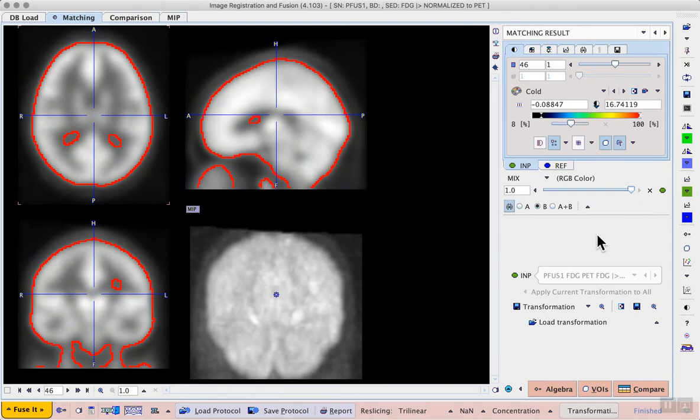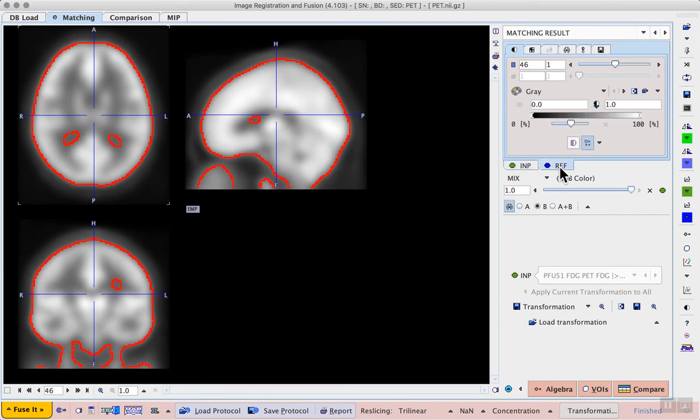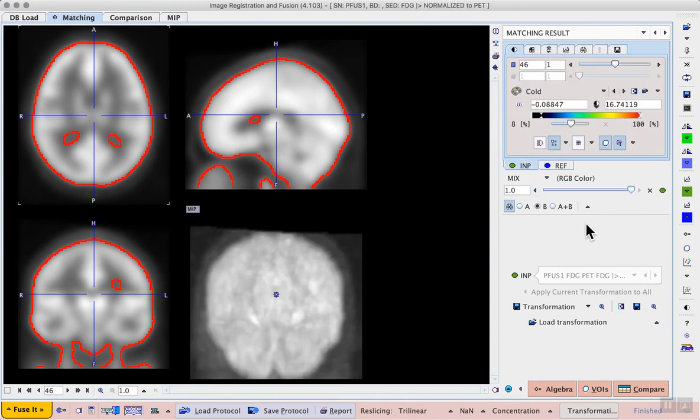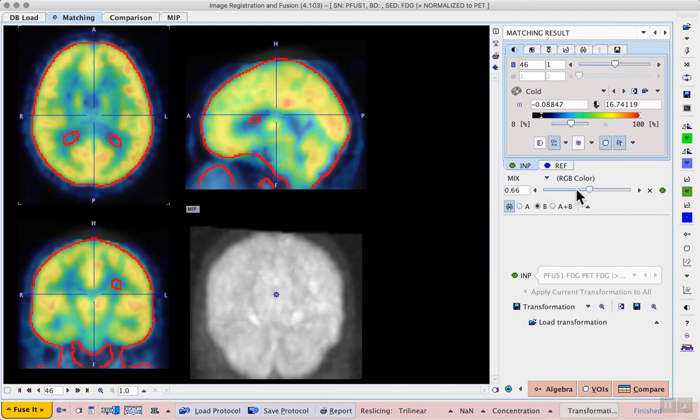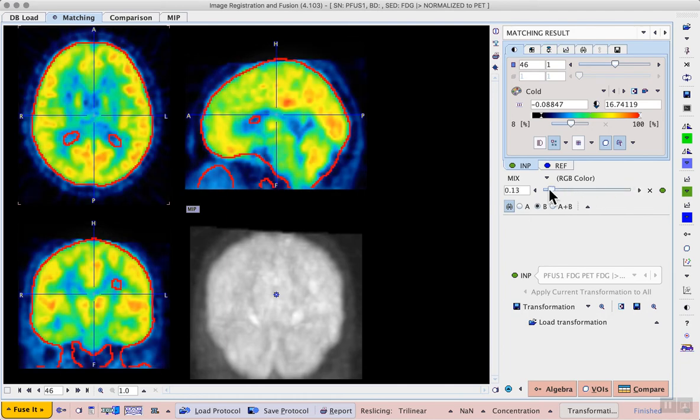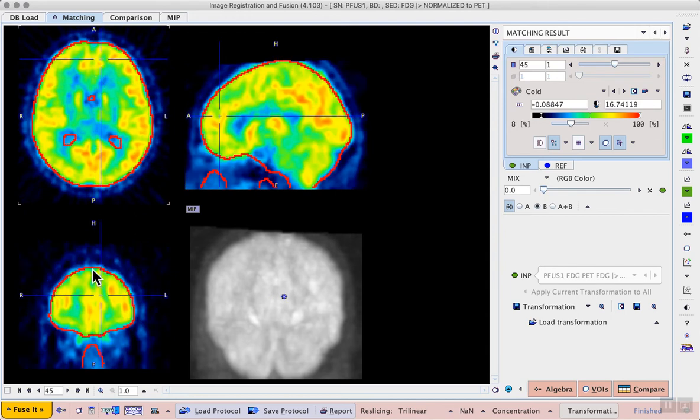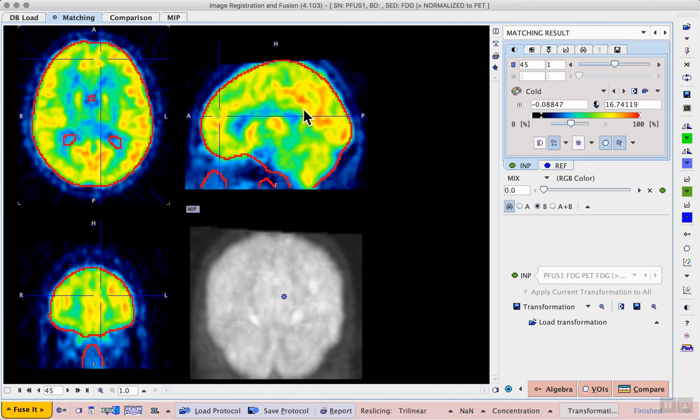And if we need to adjust it we can select the reference image controls and the contouring tab where we can change the threshold. For now I'm happy with the threshold so I can actually move the fusion slider all the way to the input image and then I can triangulate different locations all the time looking at the correspondence between that red contour and the outline of my individual brain that has been transformed to match the template.